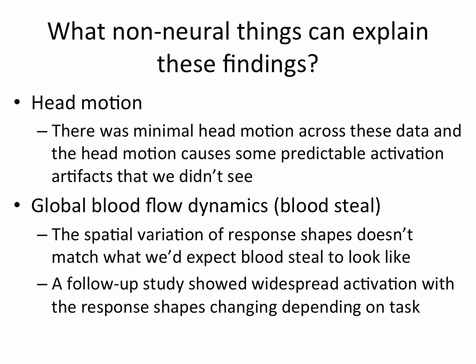So how do we rule out head motion? In general, when head motion is a big effect, we're going to see some characteristic things. You're going to see maybe one side of the brain, the edges of the brain are going to have really robust signals, and we didn't see that at all. We also recorded head movement parameters, and they were really minimal.